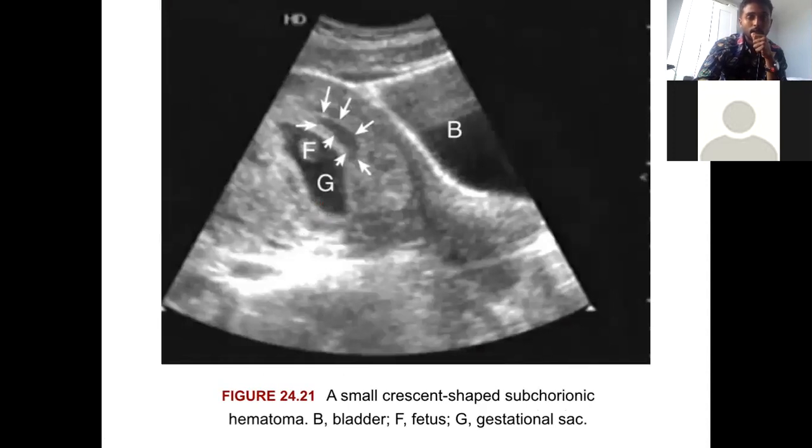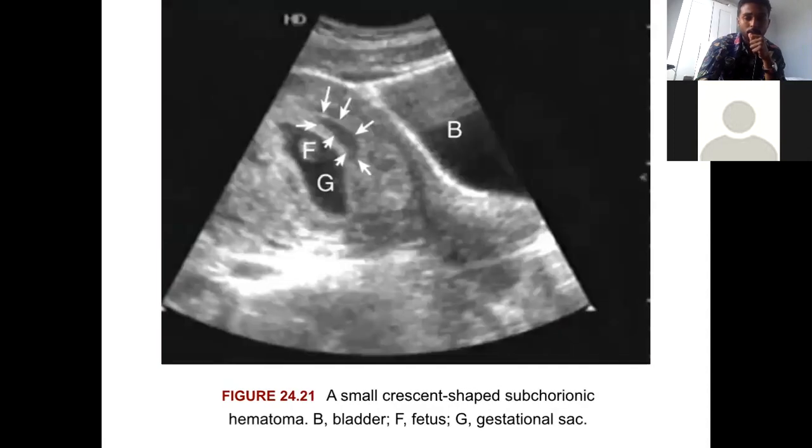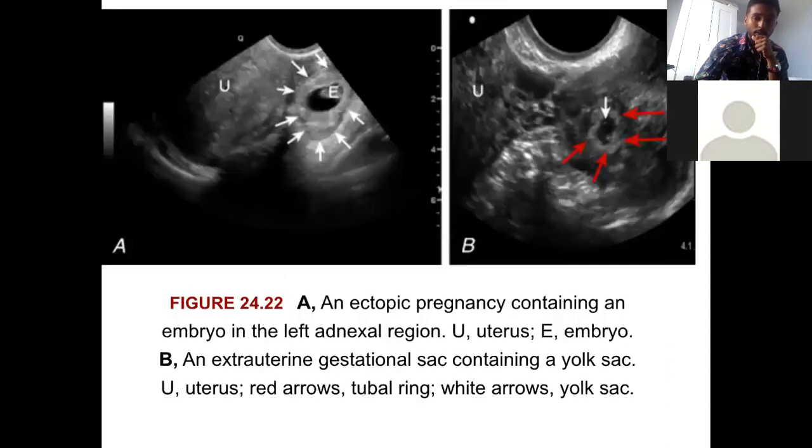So this is another one. This is the anechoic, just like fluid. Sometimes blood, it depends on if there's pus in it or whatever's in it, it can be anechoic or hyperechoic. But this is more of a fluid. This is a transabdominal sagittal view because you see the bladder in the front and the uterus behind it. And the bladder's kind of full. And I can see the transducer coming from here. So some of these things you can probably diagnose with transabdominal. If you don't see what you need to see in transabdominal, then you can do a transvaginal view.